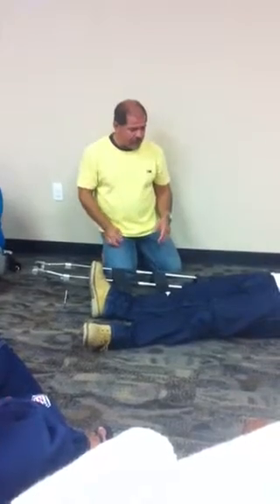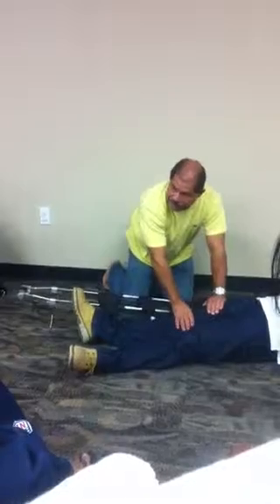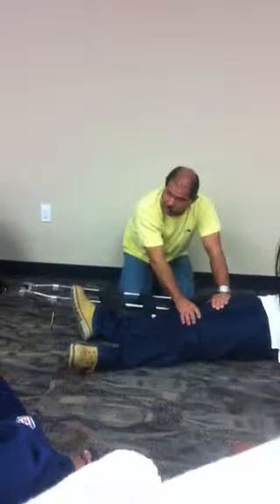Okay. All right. So I've got these in the right position, and so I was over there. Now I moved over here. Now, before Jason can do anything, rescuer, pulling traction, I have to stabilize the fracture site. And when we say stabilize, that means one hand above the fracture site and one below.